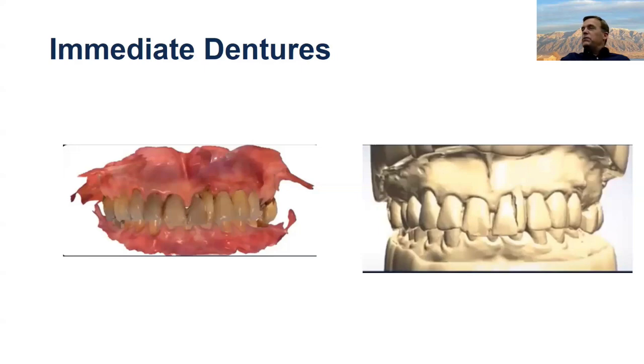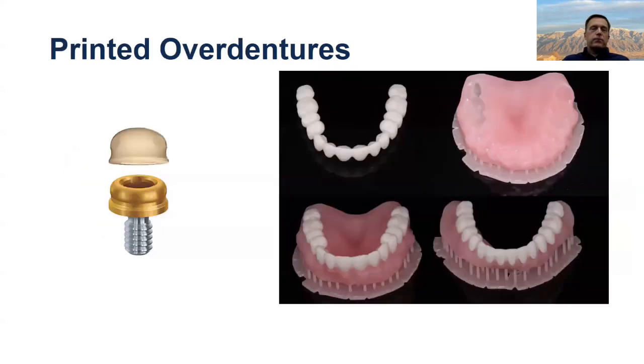And then once you've delivered that temporary denture, you can use it to do the reference denture workflow for the final restoration, which can be really handy too. So basically two scans like you take for study models, and you're ready to go for an immediate denture and basically work your way through that whole process digitally.